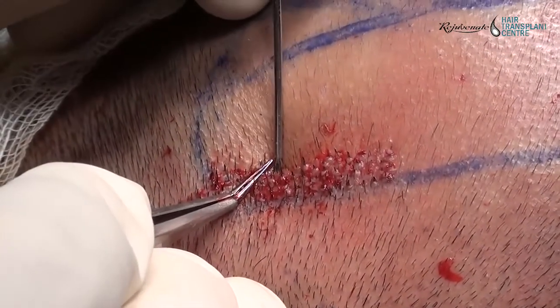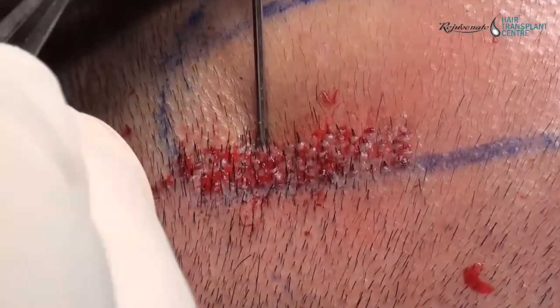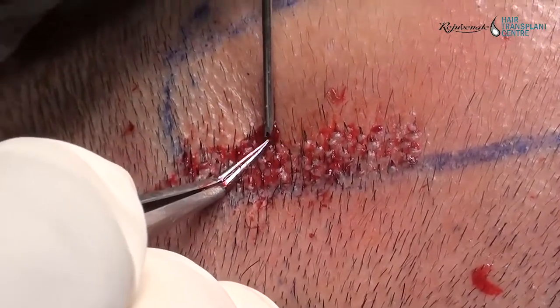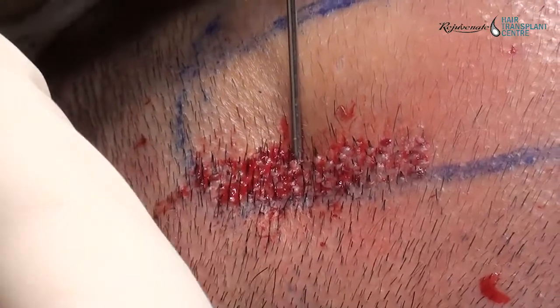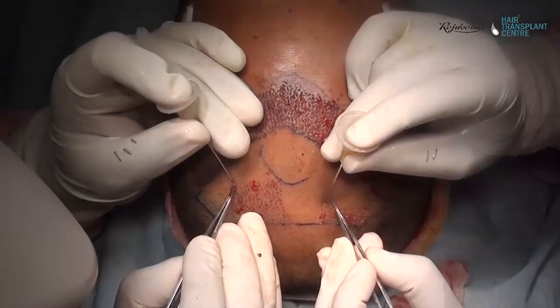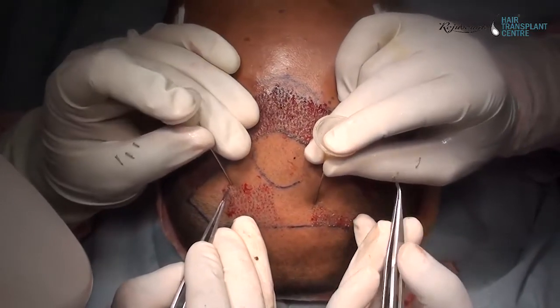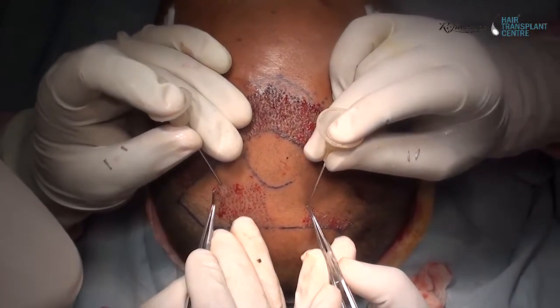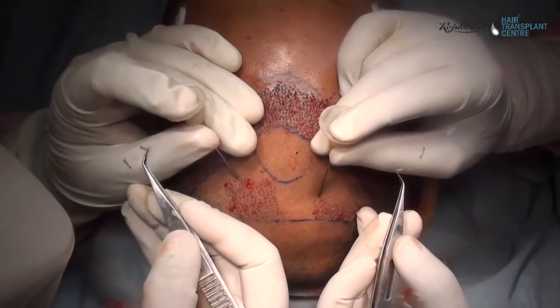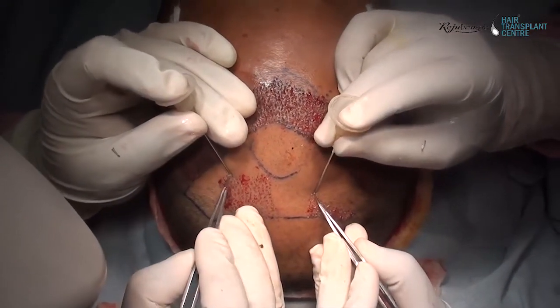To minimize trauma, a no-touch root stick-and-place technique is used, and to reduce implantation time, two implanters perform implantation simultaneously. Both implanters are of equal capability and experience, and both use 3.5x magnification.